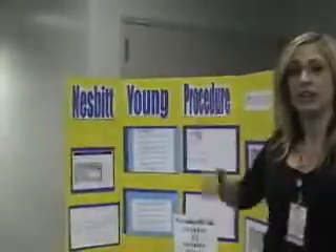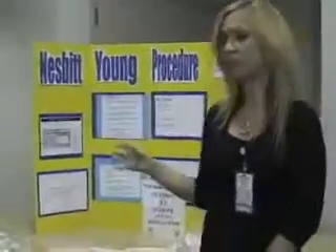Hello, nurses. My name is Jamie Last. I work at Salt Lake Memorial Hospital on 3 West Medical Oncology. I'm going to be demonstrating to you today how to use a Nesbitt Young irrigation. Nesbitt Young irrigation is an intermittent irrigation — it's not continuous. Most of the time, the irrigation set is set up after a surgery called a TURP, which is a Trans-Urethral Resection of the Prostate.